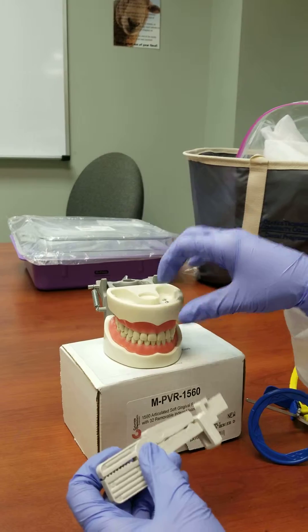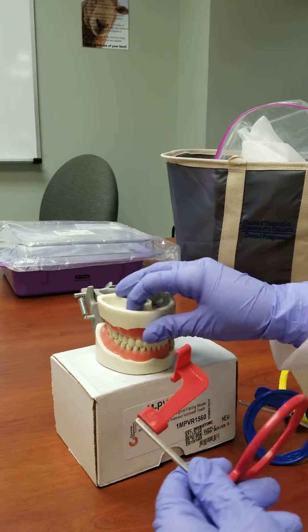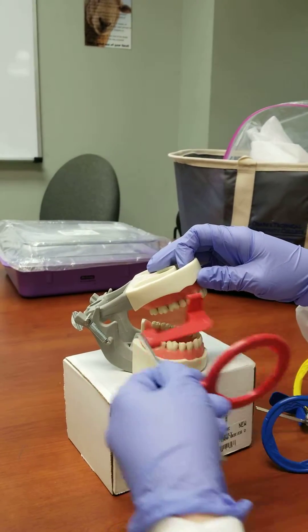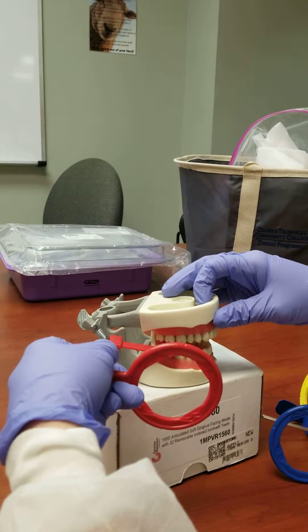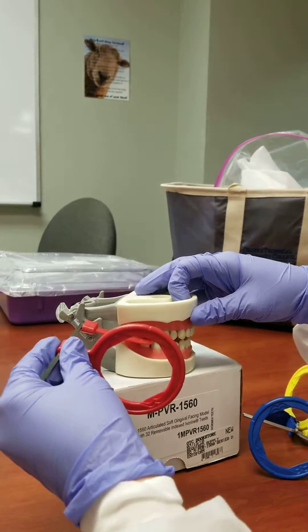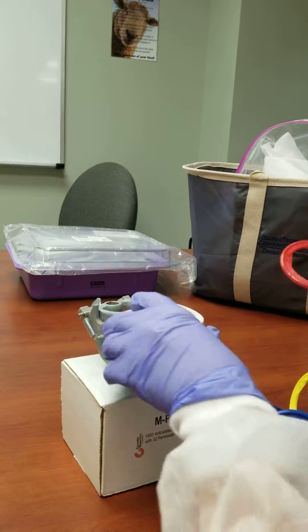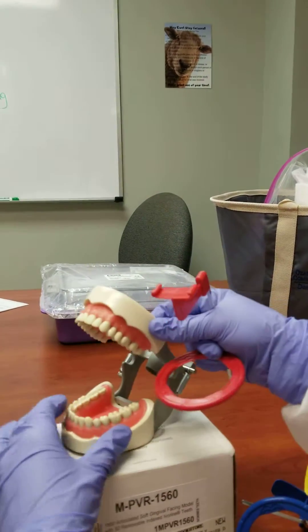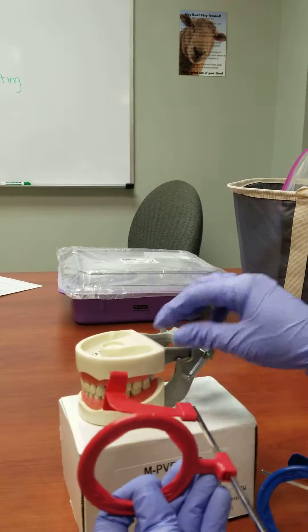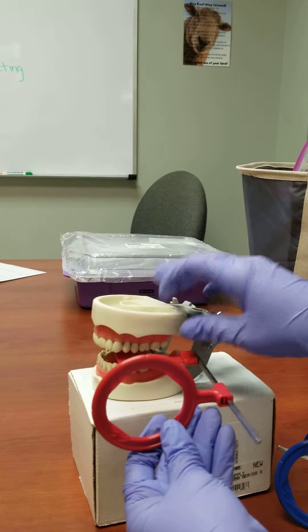And then I'm going to do a right horizontal molar, so here are the molars. And then I'll do the left horizontal premolars. They bite on it, and that's it. Thank you.